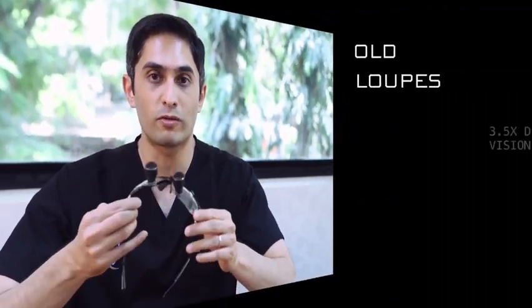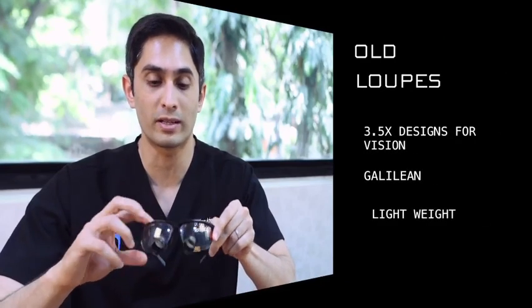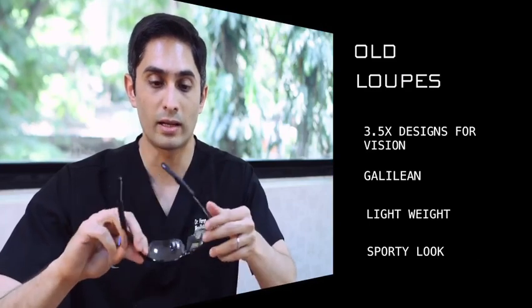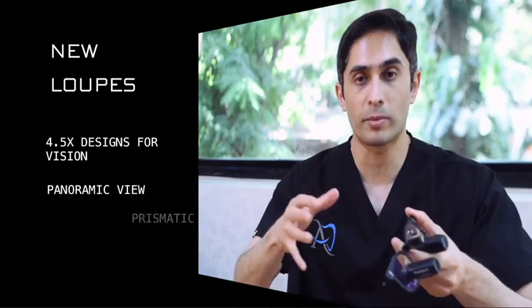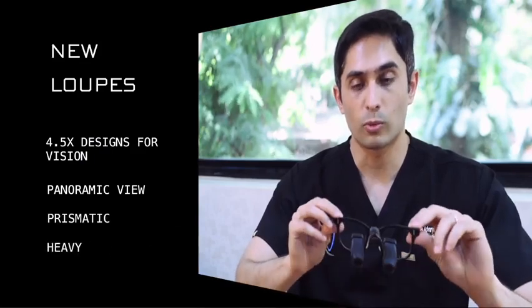My old loops are the 3.5x Designs for Vision — they're Galilean, not prismatic, so they're very light and sporty. I still love them, but I wanted more magnification. That's where the new 4.5x expanded field loops come in, offering a panoramic view. But there are trade-offs with the expanded field, the 4.5x magnification, and the fact that these are prismatic rather than Galilean.